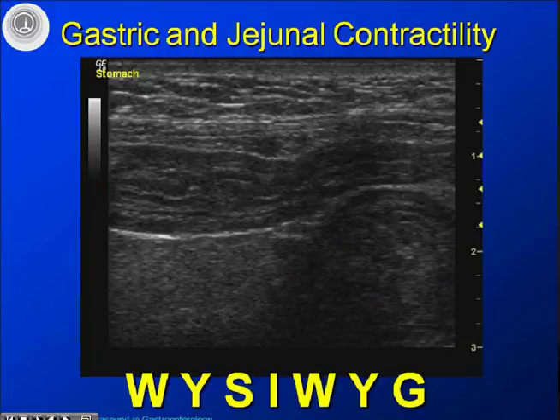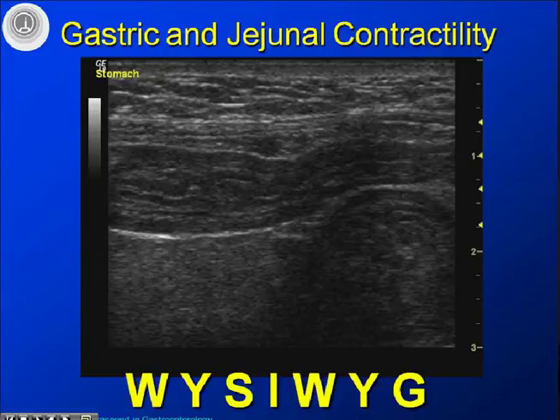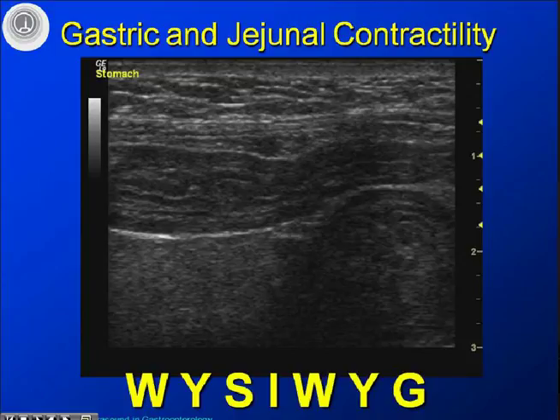Starting in the upper GI tract, this video shows the difference between a contracting antrum and a contracting jejunal loop. They have different ways of contracting: while the jejunum normally contracts with 12 contractions per minute, the antrum in a fed state is only three contractions per minute, and you can appreciate that difference on this image.